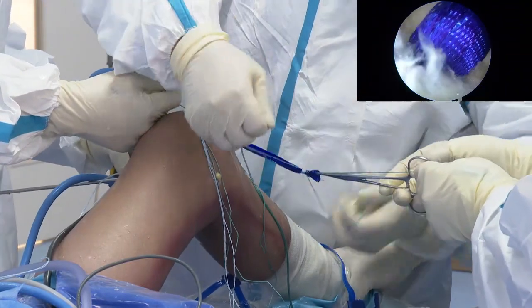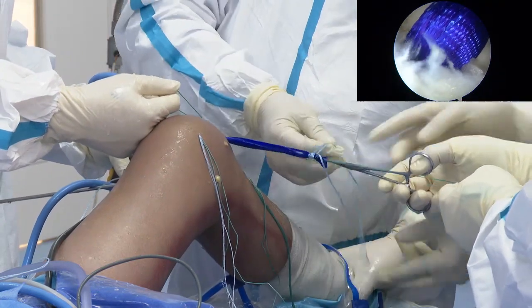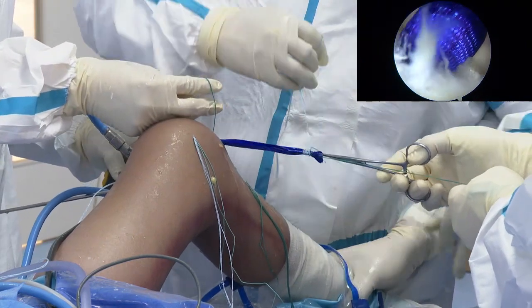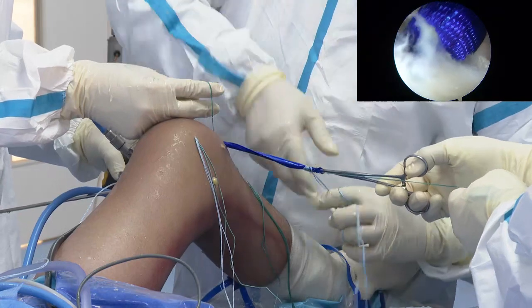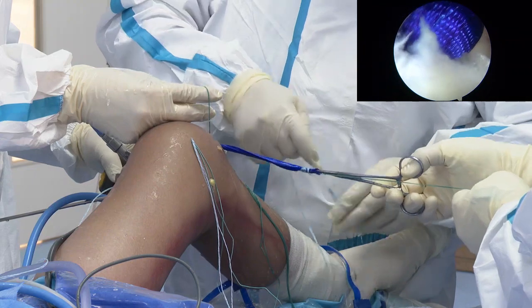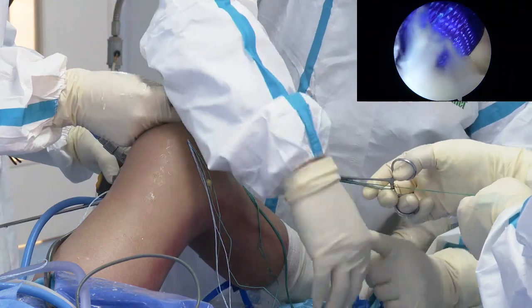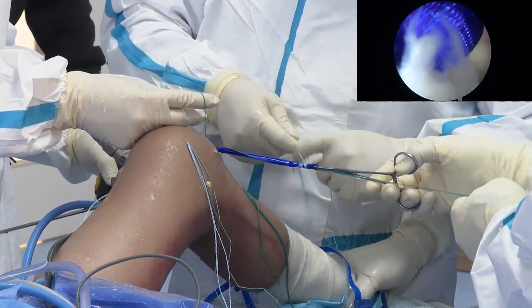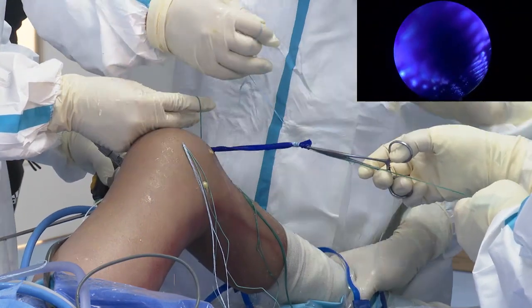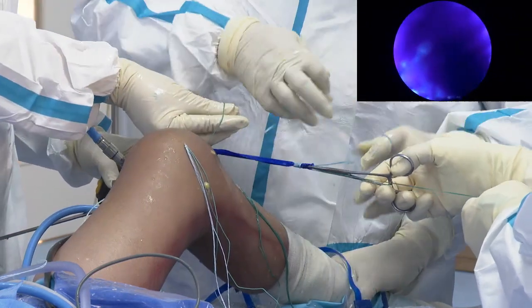Okay, you can hold this way and then go around two times. Because you need really strong sutures for the PCL. Because many times with the PCL, you turn the screw. Because for the PCL, I want to put the screw really deep inside the joint. The PCL graft needs really strong sutures, because when fixing, the screw I place will be turned in very deep. Okay, good.